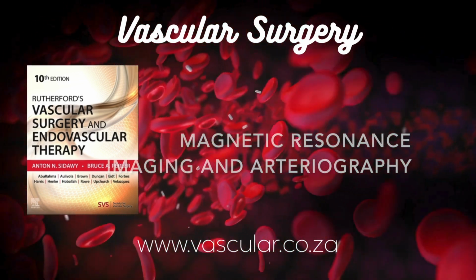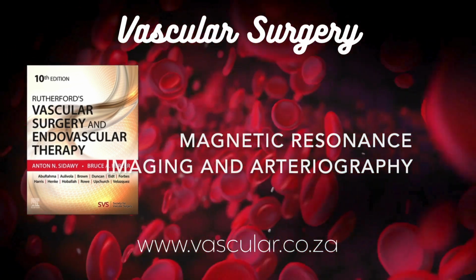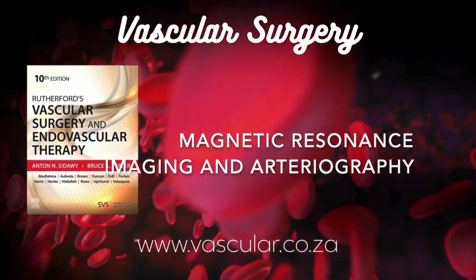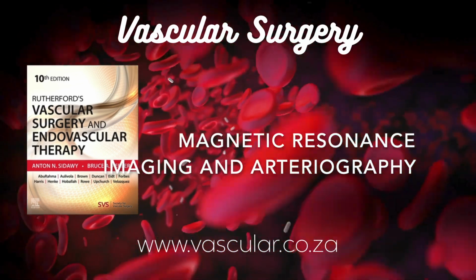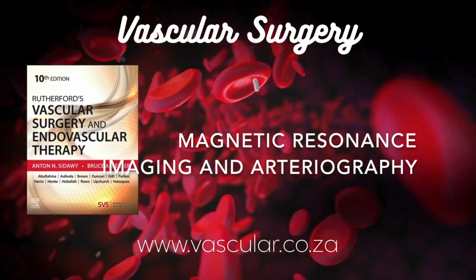You mentioned trade-offs with 3T earlier, though, the RF energy deposition. Yes, that's the main one. At 3T, the amount of RF energy deposited in the patient, measured as the specific absorption rate, or SAR, is 4 times higher than at 1.5T. 4 times, wow. Yeah. There are strict safety limits on SAR, and you hit those limits more easily at 3T.